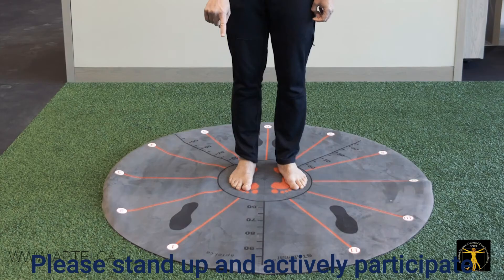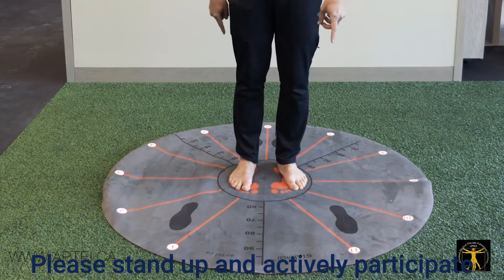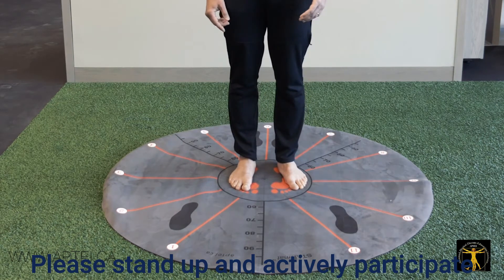The StarMat has 12 clock numbers on it — 1, 2, 3, 4, 5, 6, 7, 8, 9, 10, 11, 12. And you can do an unlimited number of exercises on it.